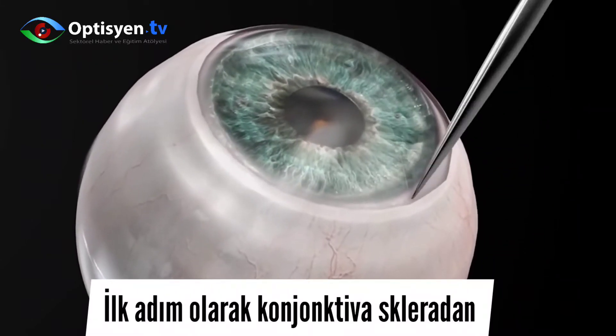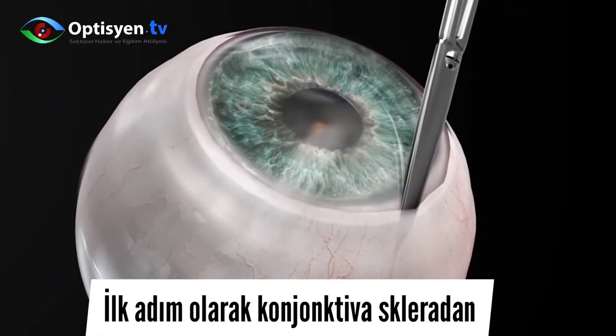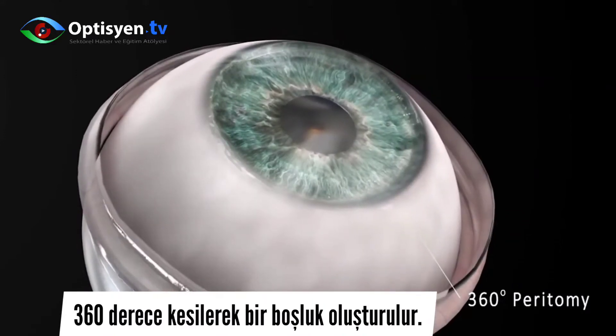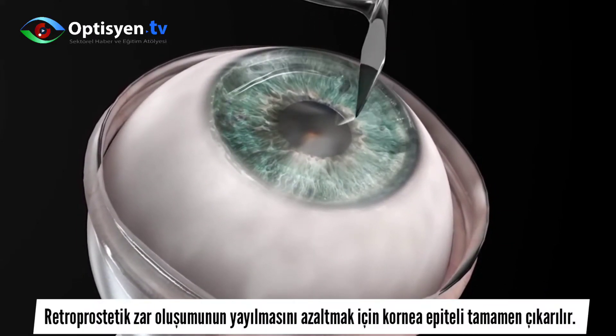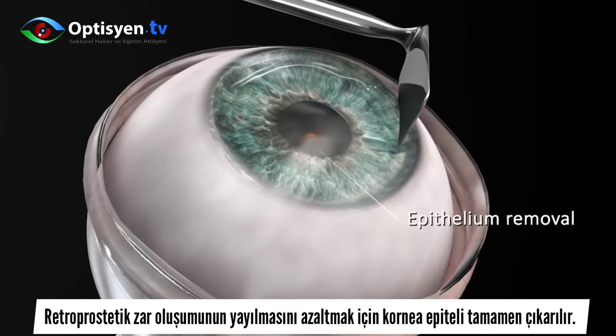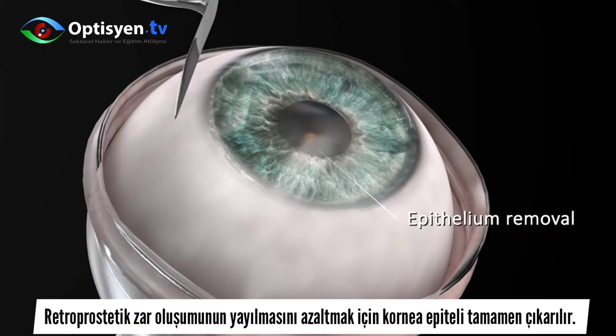As a first step, the conjunctiva is dissected from the sclera, 360 degrees, creating a pocket. In order to decrease the prevalence of retroprosthetic membrane formation, the corneal epithelium is completely removed.